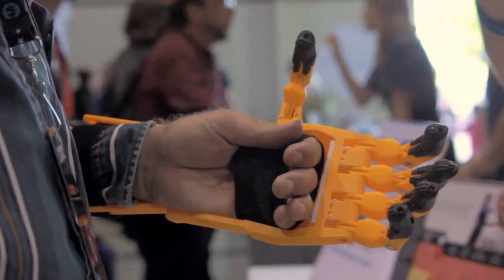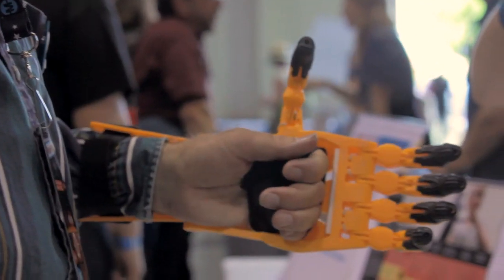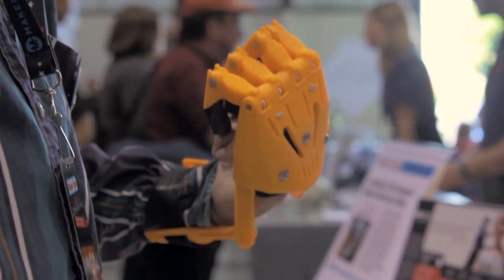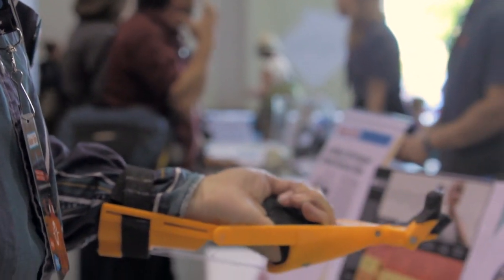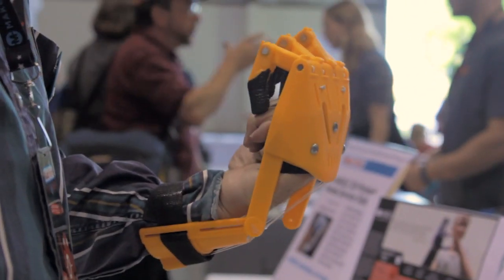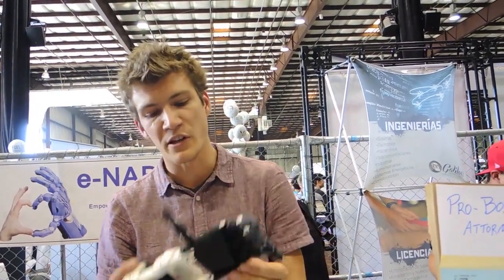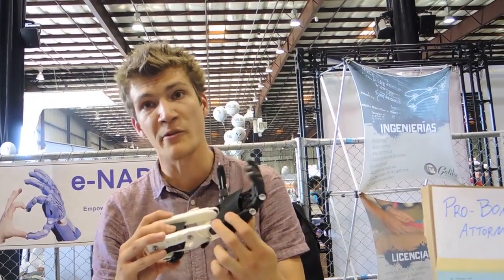Those are all things that contribute to it being incredibly low-cost compared to existing commercial systems. This whole device costs probably under $150, and you can make them much, much cheaper. We mainly deal with children who are affected by something called amniotic band syndrome — a birth defect in which the child is born without any fingers but with a fully functioning palm, so they have muscles and a palm that we can harness to drive this mechanism.